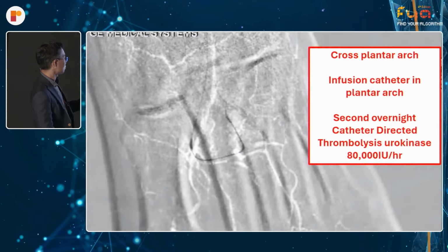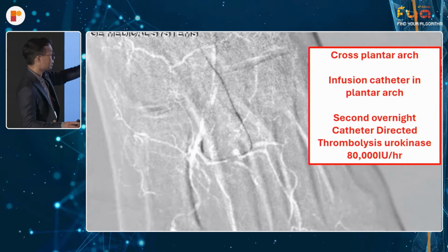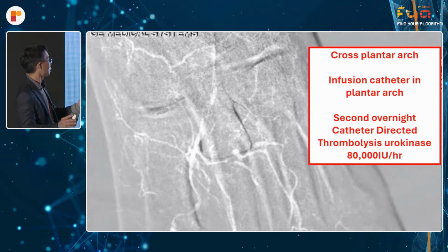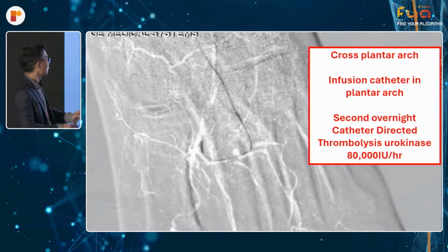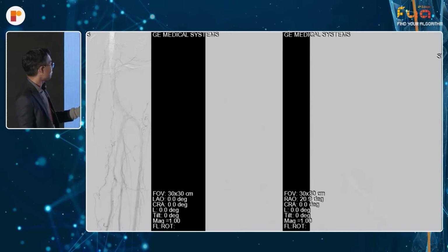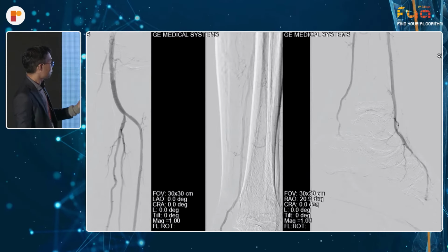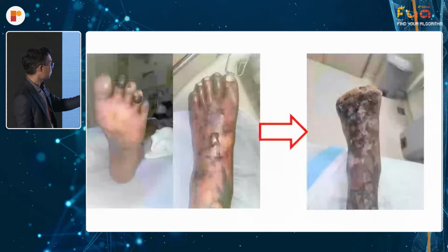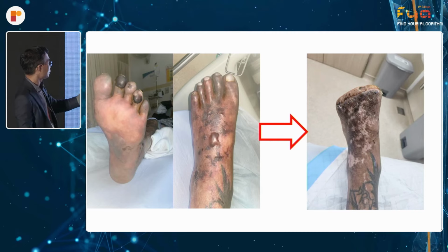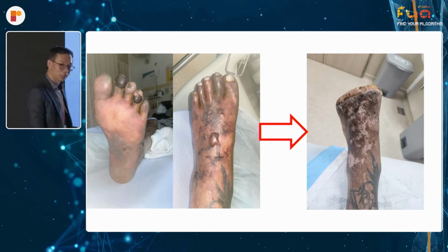In this instance, really, we chose to go around it. And by going around it, the advantage is that we were able to put our Cragg-McNamara infusion catheter in the plantar arch itself, gave him a second overnight catheter-directed thrombolysis, and this is the end result the next day. With a reasonable flow around through the arch with a palpable dorsalis pedis pulse, and this was him about 1 month later with a forefoot, and you can see the fixed mottling is all healed.